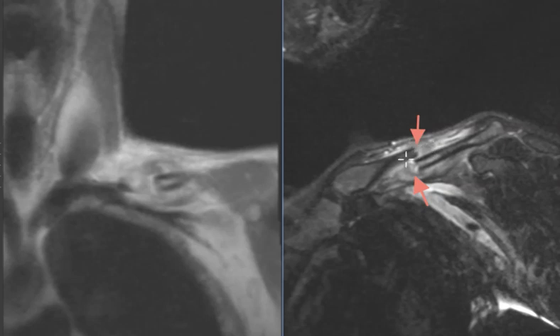And you see all the gray signal all around this. This is edema and hemorrhage, tearing of the deep muscles, and some blood products surrounding that. So a fracture of the midshaft of the clavicle that did not show up on x-ray.